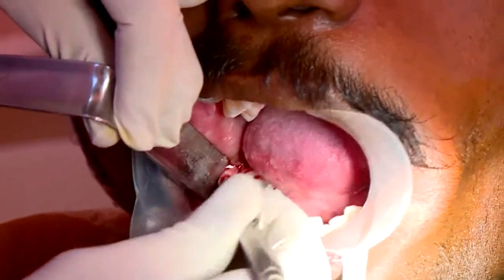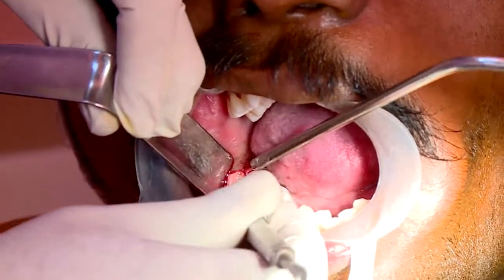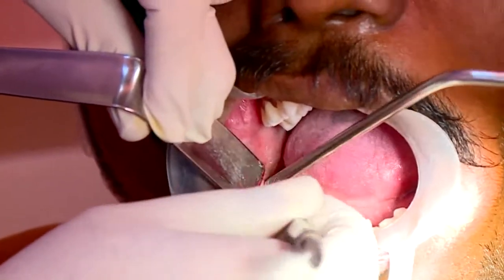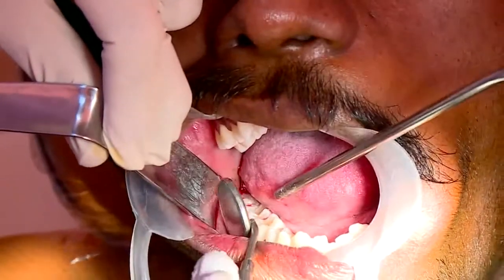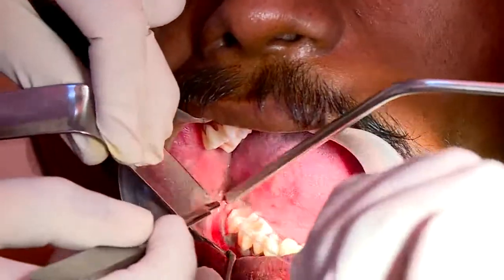Right? So this is the sulcus. Now he is using an elevator to open up the flap. He is using this pointed end to pry the interdental papilla off. Can you see that? And this is a small distal release that he has given in the bone.